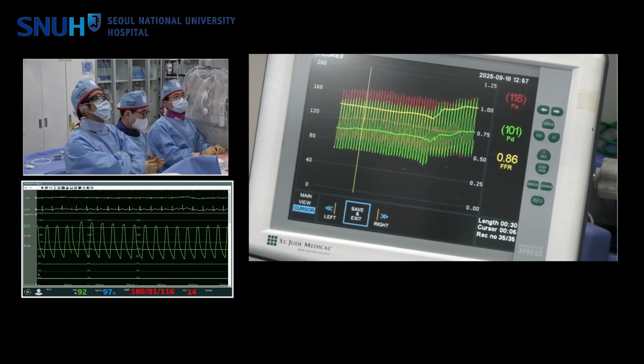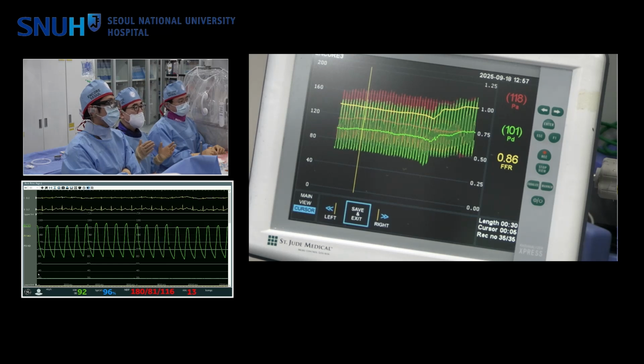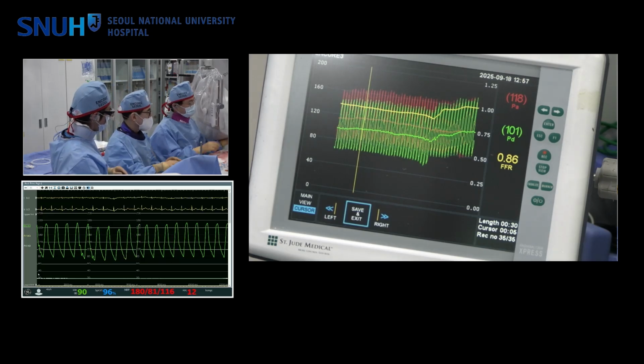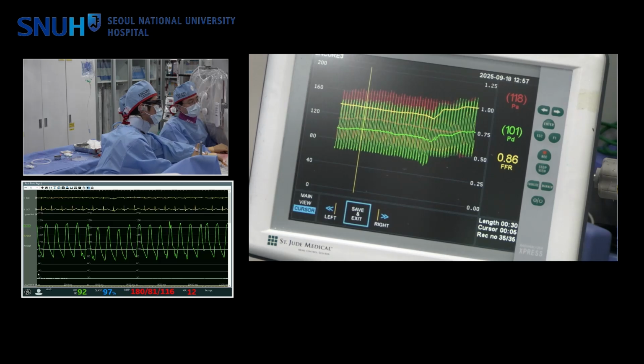Yeah. Okay, then we are taking another angiography to reassess the mu FFR for circ. 아까 다이 플로우 되지 않게끔 잘해가지고 한번 찍어보지. Okay, test please. 이 view 괜찮을까? 다시 세잖아. 인게이지를 해야 돼. 제대로.